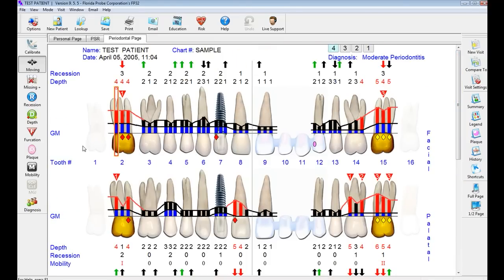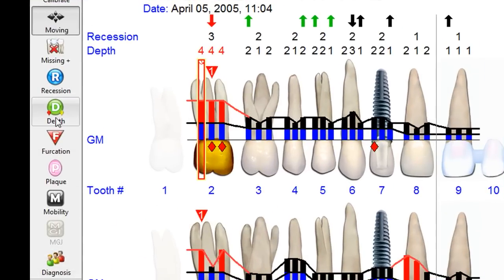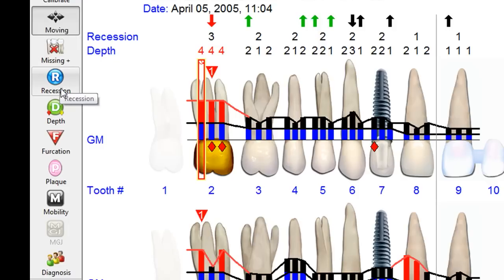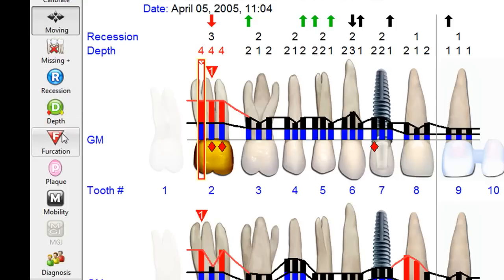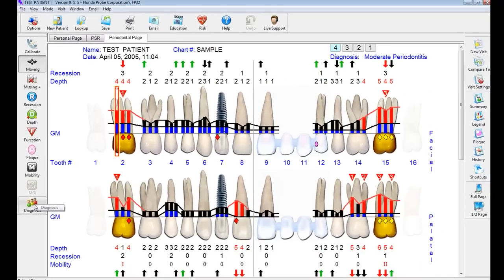On the left-hand side of the screen are all of the things we can use to enter data with. We can mark missing teeth. Recession can be either positive or negative from the CEJ. We can chart pocket depth, bleeding, and pus, furcation, plaque, tooth mobility, mucogingival junctions, and set a diagnosis.